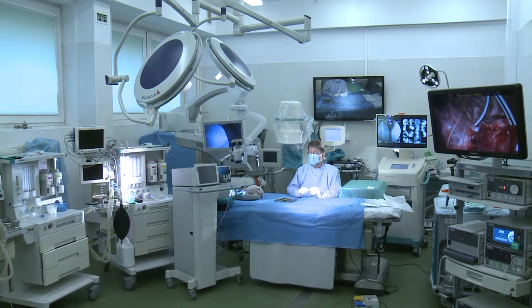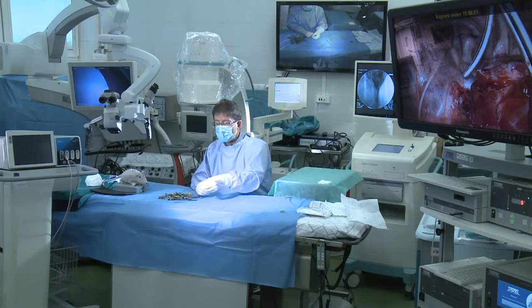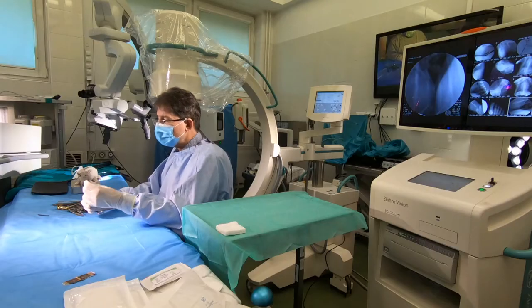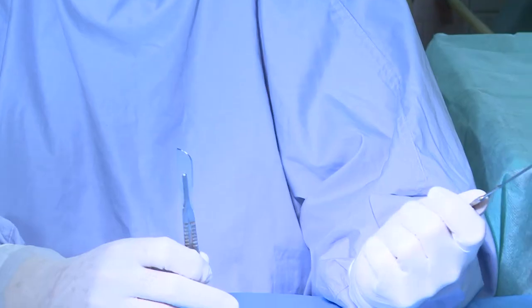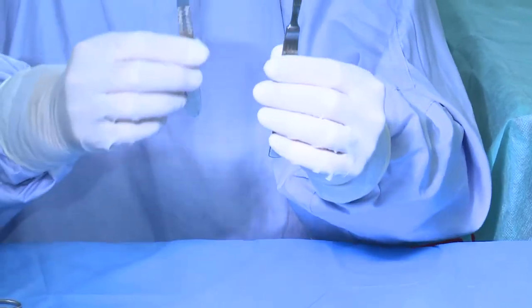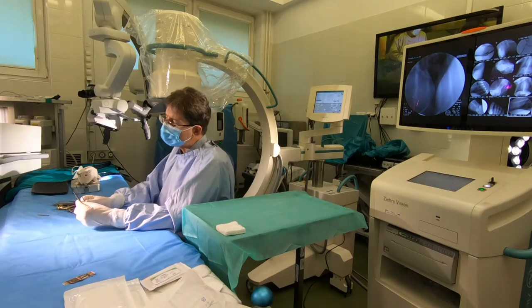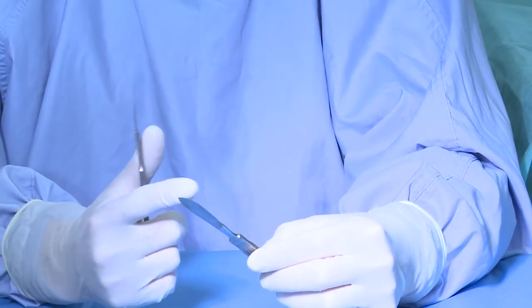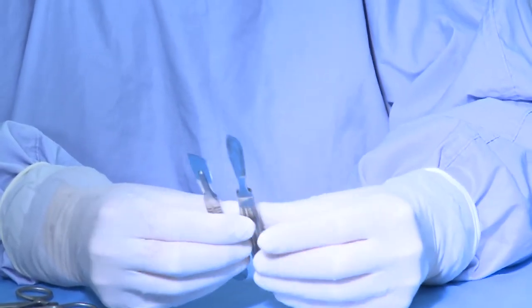So, first of all, we start from cutting. For cutting, we use knives. Here you have two kinds of knives. One which is non-disposable — we can use it many times. You have a cutting part and a holder. That was used since centuries in that shape or simply a slightly different shape, but it was necessary to sharpen the edge before every surgery.